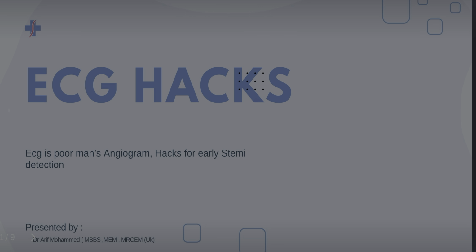In this video, I'll be discussing some ECG hacks that will be useful in the ED.